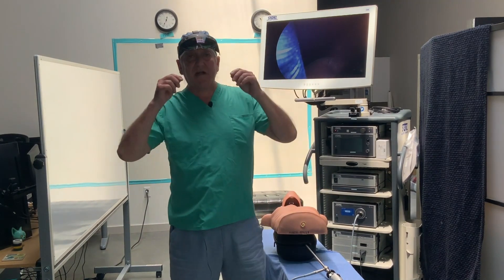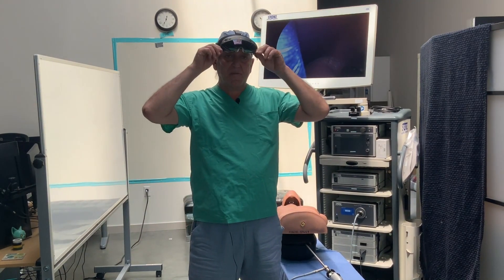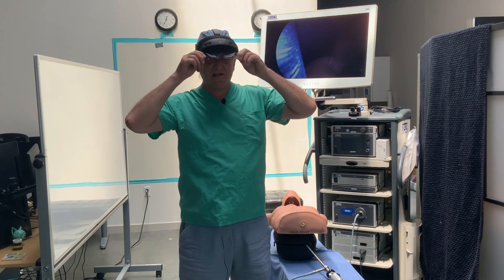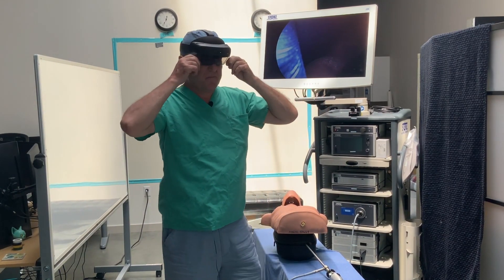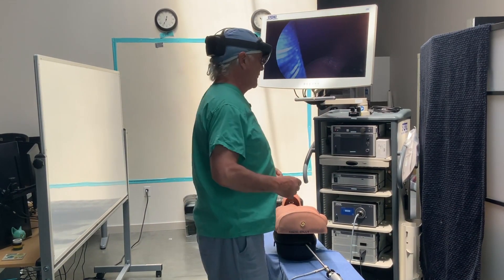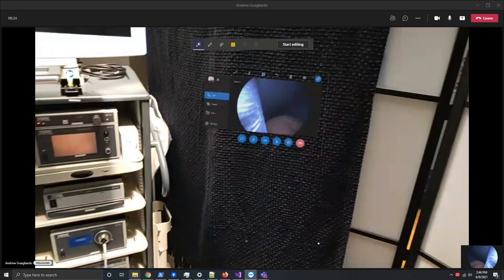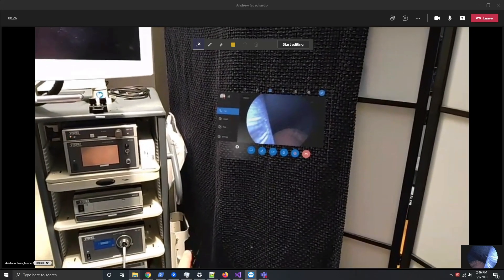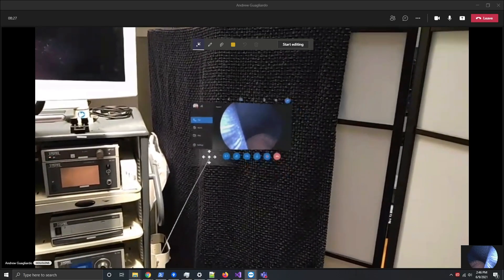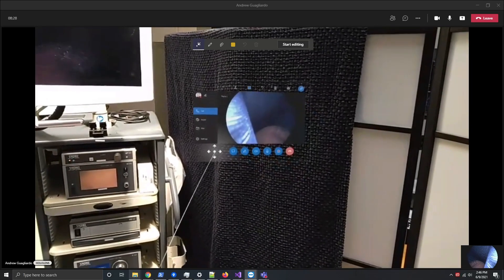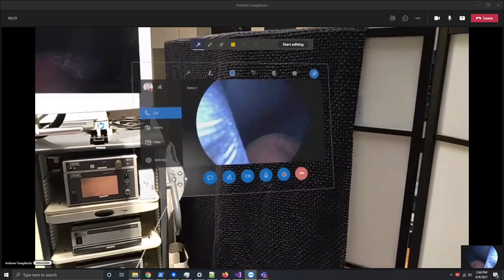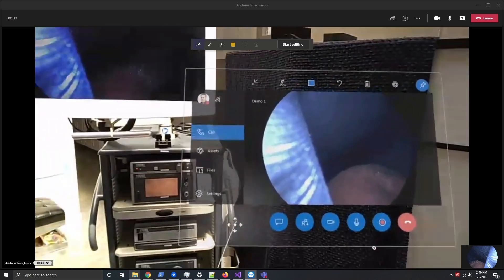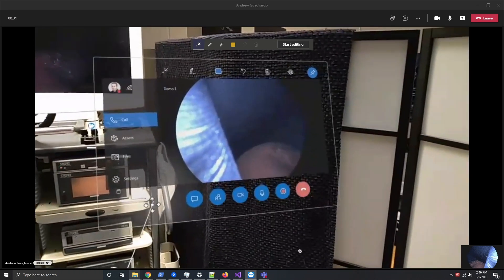Now let's take a look at how we can do this using the Microsoft HoloLens 2. You'll notice I now have this screen in front of me and I can bring it very close to where I want to be.